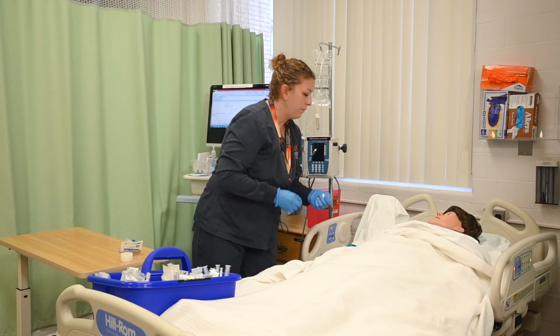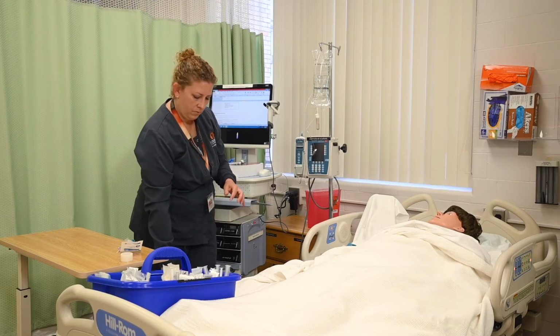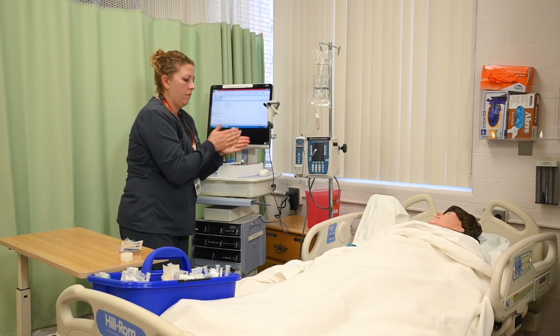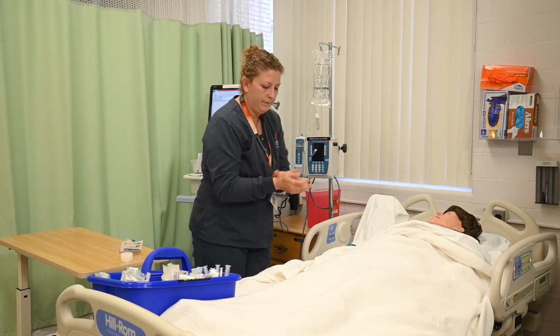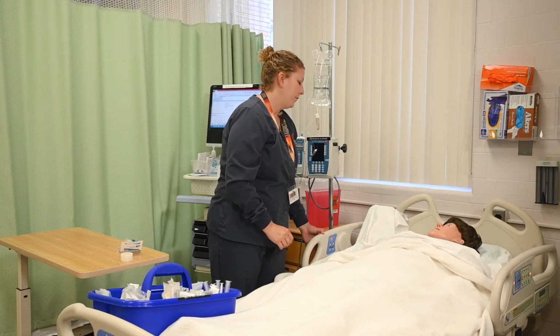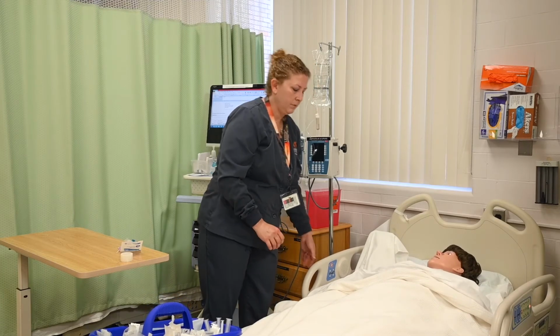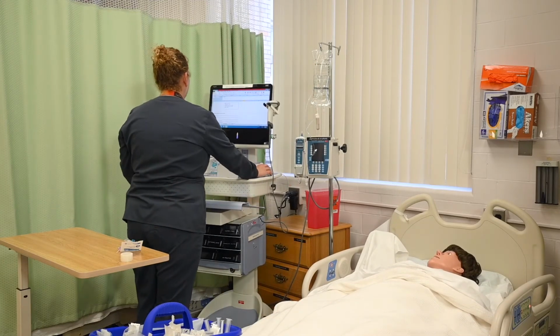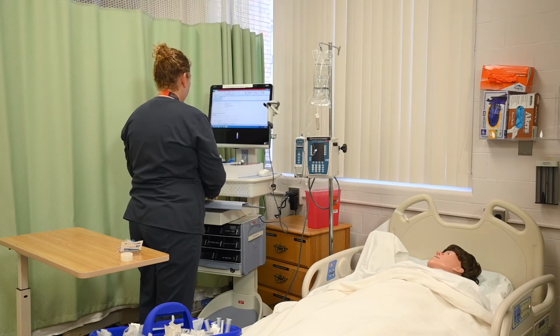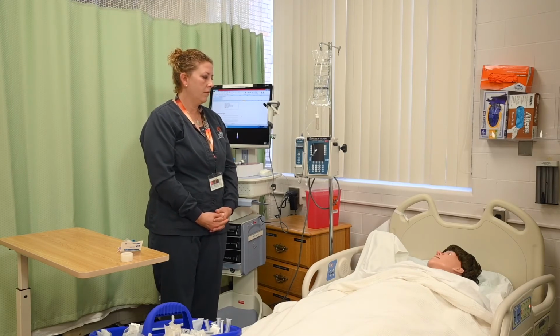You can take this off in about an hour. Reposition the patient for comfort. Place call light within reach. Leave patient safe. You have your call light. Document the procedure performed, the intactness of the catheter, appearance of IV site, and patient tolerance of procedure. Sarah has maintained professional demeanor and language and safety throughout the procedure. The procedure is complete.